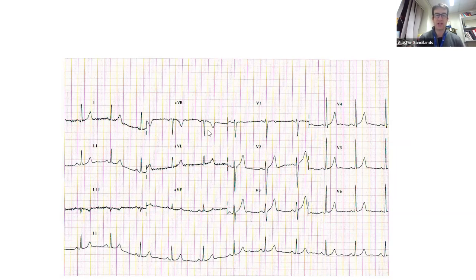Are there any T wave changes? Yes, there are T wave changes in AVR, but everything is negative in AVR. So T wave inversion in AVR. And there is T wave inversion in lead 3. Again, that is normal on its own. I'll talk to you about that in the T wave changes week. Okay, so this is a normal ECG.